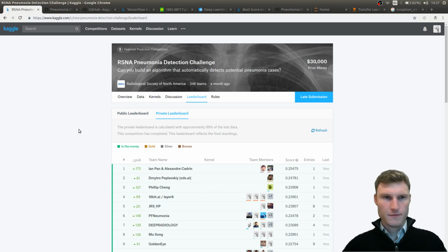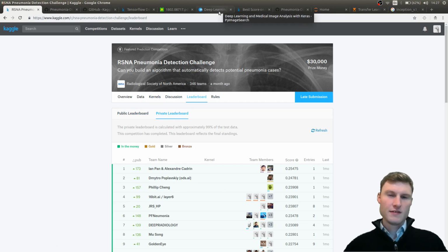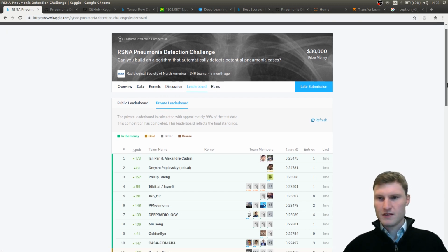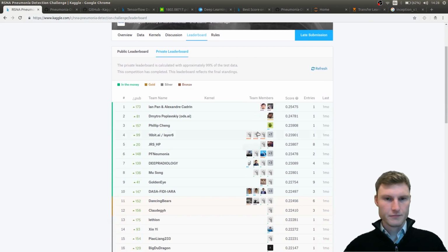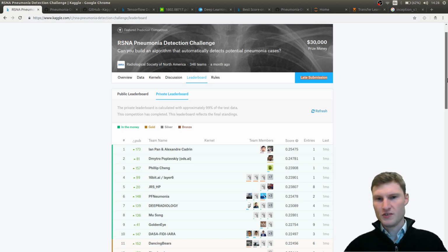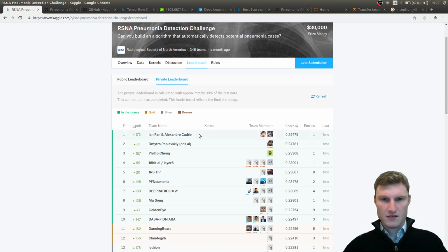We also have, here's again another pneumonia data set, and here the task isn't just about detecting, but it's about segmentation or detection. And this is actually this year's; the winners were invited to RSNA to present their results. Actually this guy won.